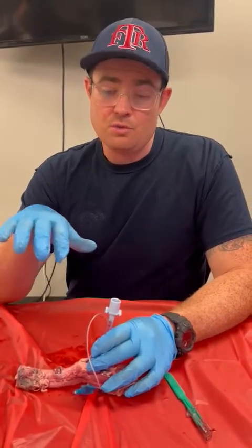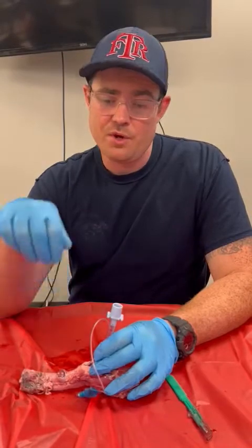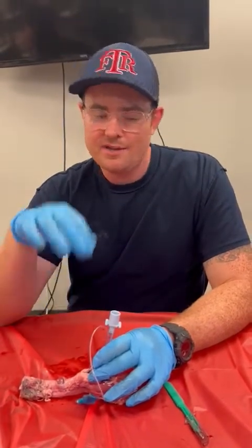The only way that you can truly mess this up is if you cut too far down or you don't cut enough. Once you feel that pop into the trachea, now you know you're in — you can go ahead and slide down your tube. Just make sure you're securing it with some sort of tape or other device. And that's it.